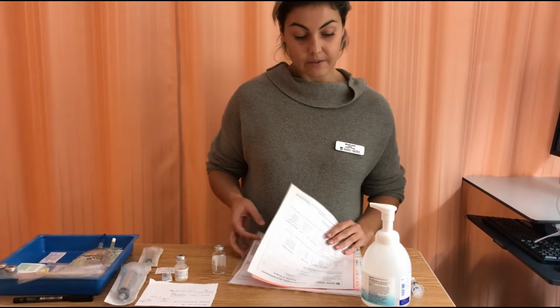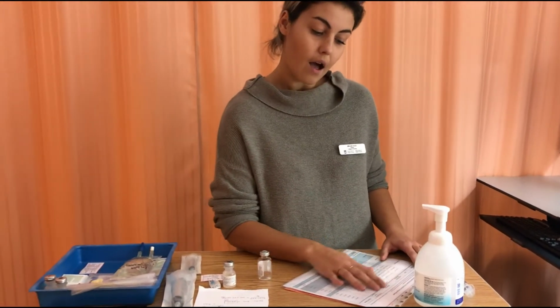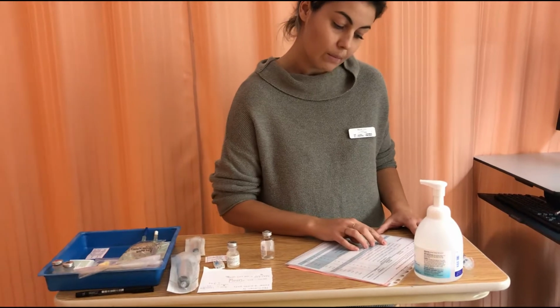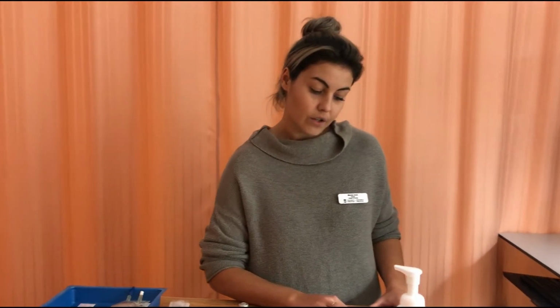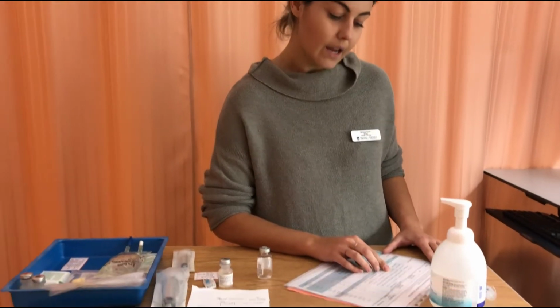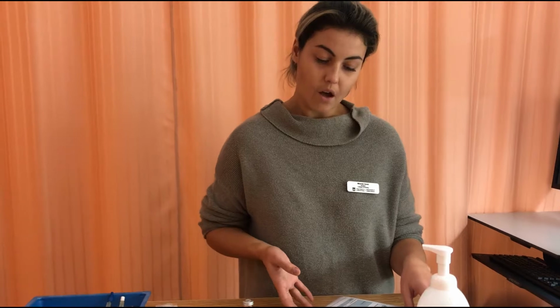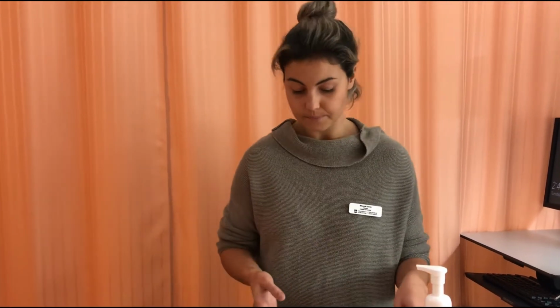And for the CIVA, I'm going to look at the CIVA pump infuser administration record. And for 3 million units, I'm going to be putting 30 mLs in a 30 milliliter syringe on the normal rate. And it's going to be infused over 35 minutes.